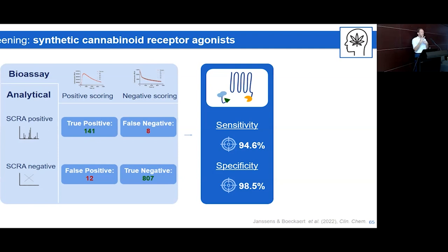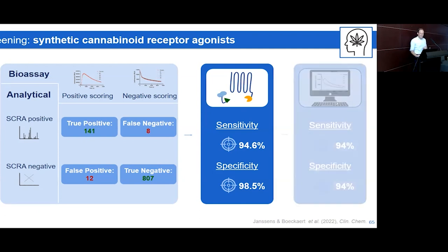There were two samples where we got a substantial signal. We are quite confident that they actually are positives, but they weren't confirmed via high-resolution MS. There wasn't sample left anymore to repeat the high-resolution MS, so we'll never know. We also called those false positives because it's a screening assay, and we consider the high-resolution MS the gold standard. If it's not confirmed, we call it a false positive, although in some way we're quite sure it was positive.